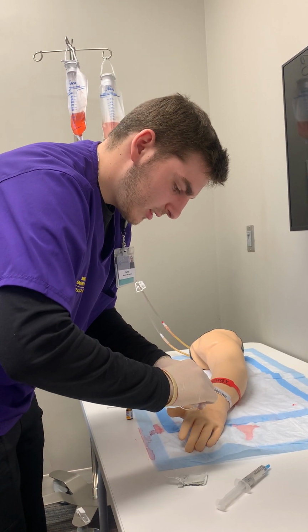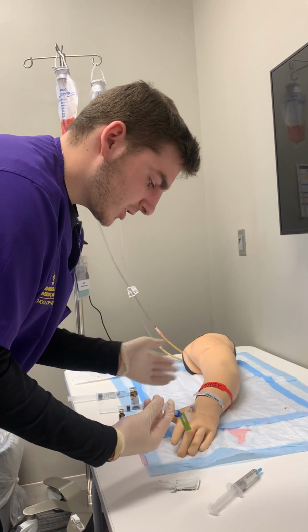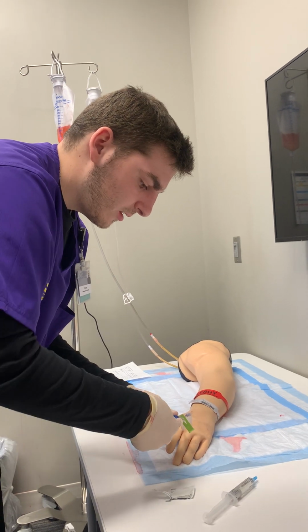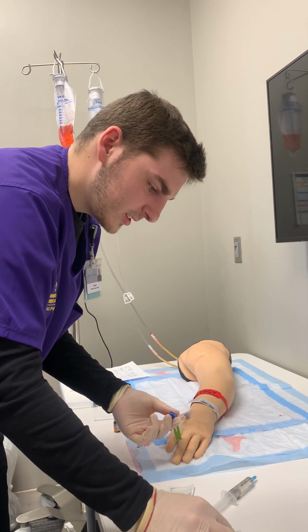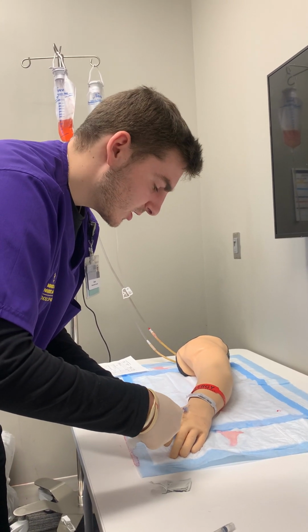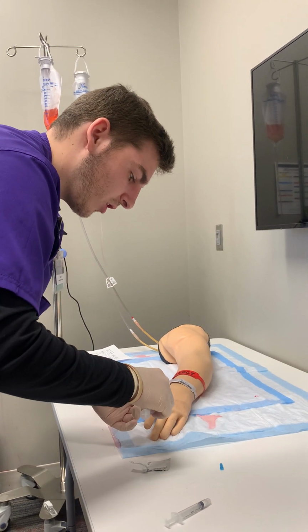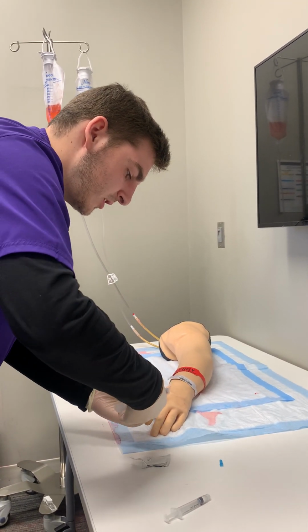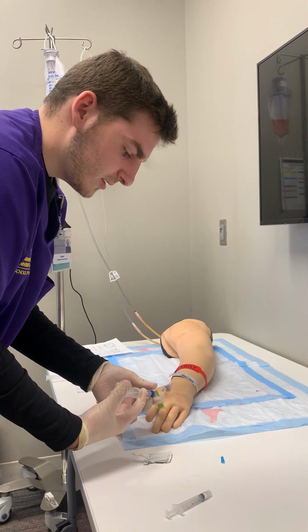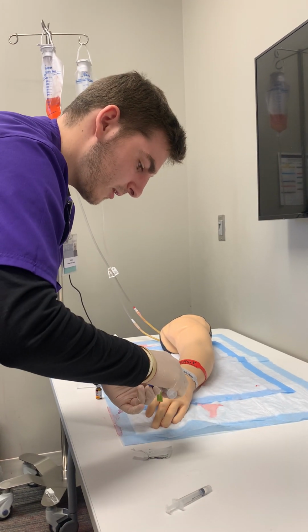Then I'm going to inject this for 15 to 30 seconds, and I'm just going to verbalize that rate, and I would inject that. And then I can take this off, and this is empty now. And then I want to flush at the same exact rate, and this is just going to prevent incompatibility, meaning any adverse or unwanted effects in the tube. So I'm going to push this at the same exact rate, 15 to 30 seconds, right? Then I'm going to recap this again.